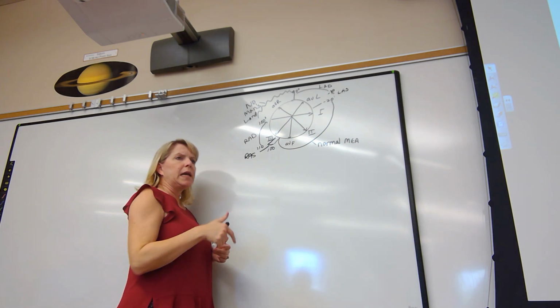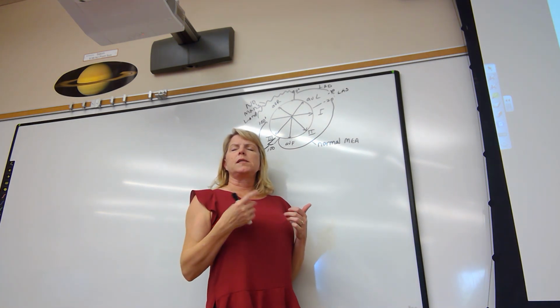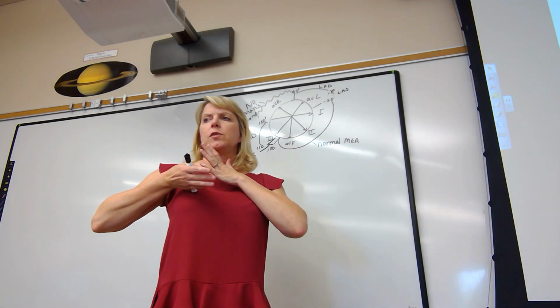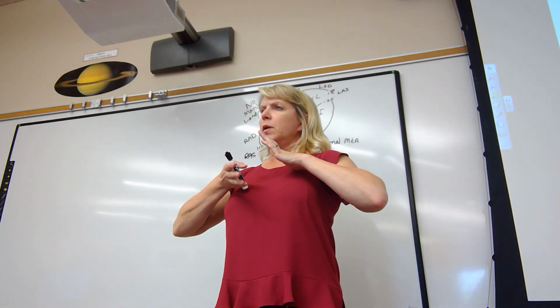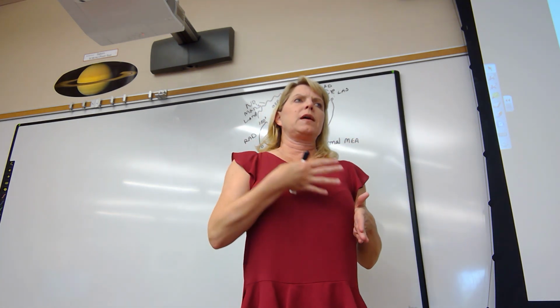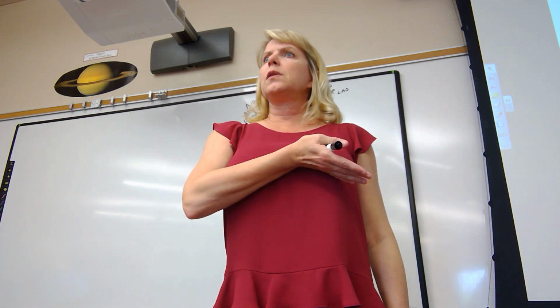Why? MEA stands for mean electrical axis. Mean in math stands for average. An average vector to describe the overall direction of current going through the ventricles. It should be down and to the left.